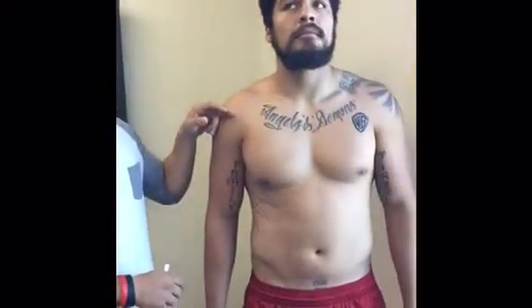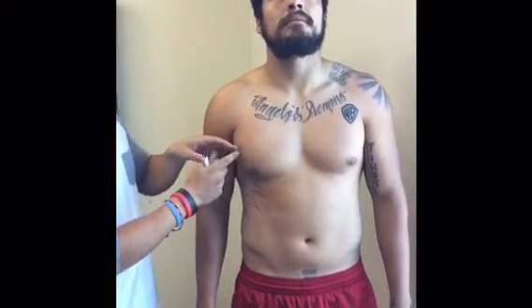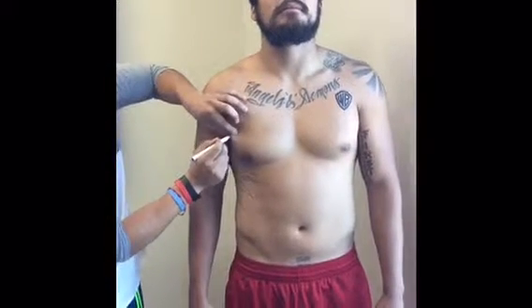So for the third assessment, we're going to be marking the chest. It's a diagonal fold. For men, it's 1/2 of the distance from the anterior axillary line and the nipple. So it's right here. And for women, it'd be 1/3 of the way.